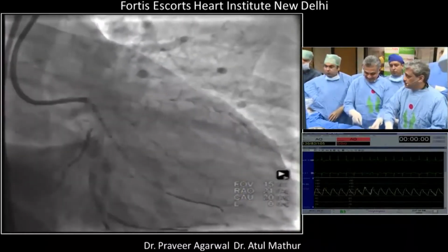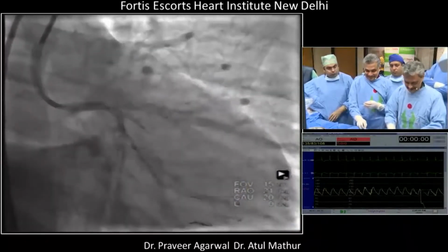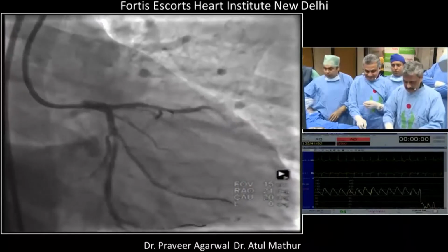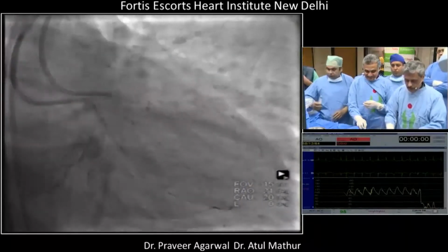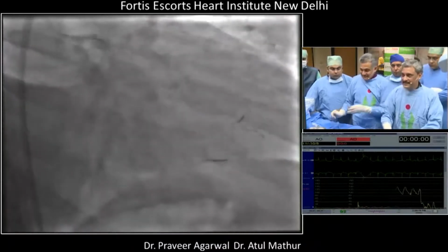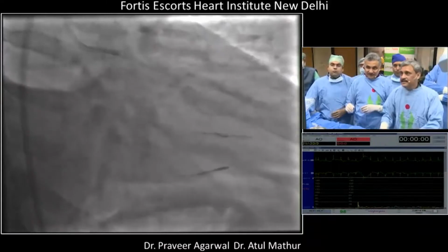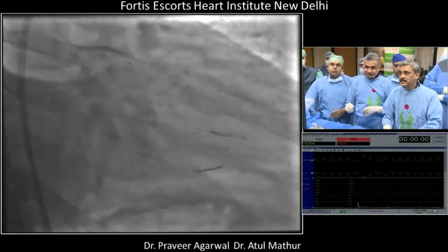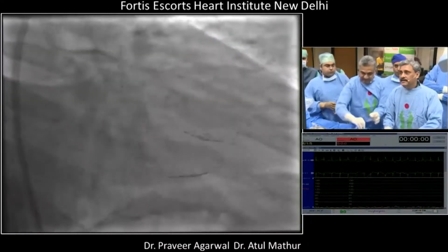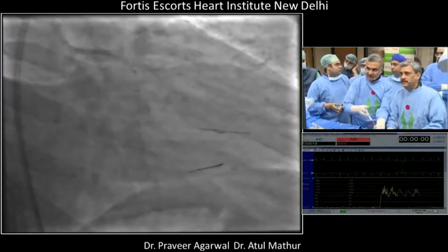Negative, it's not completely happening. No, approximately we did 18. Please be careful. No, I can feel it. Not like 28 in the other case, right? No, haven't tried it. These wires have gone a little forward. This is where we have to cut. That's the bifurcation. Ahead it's soft.